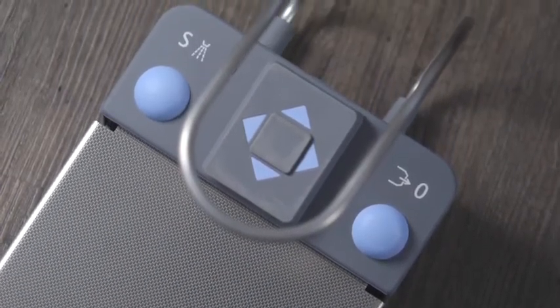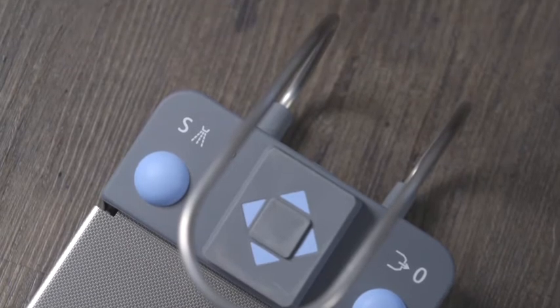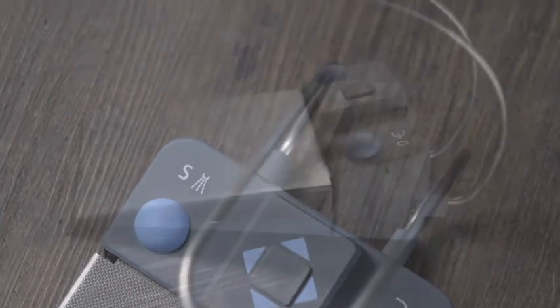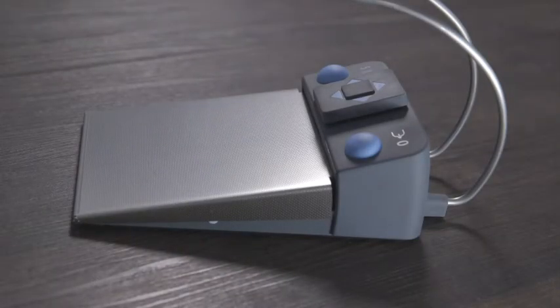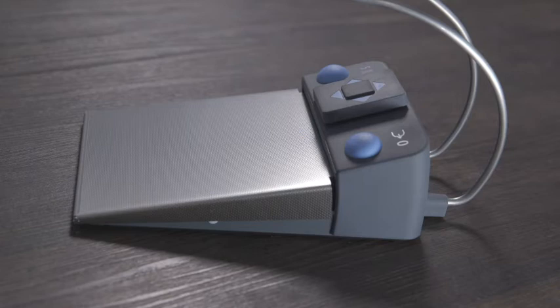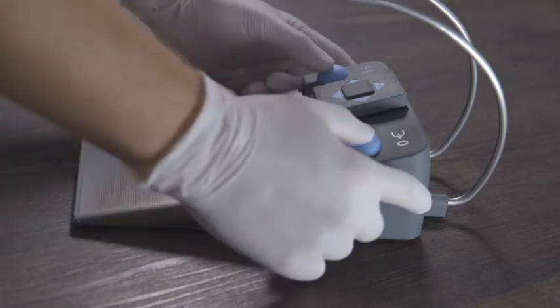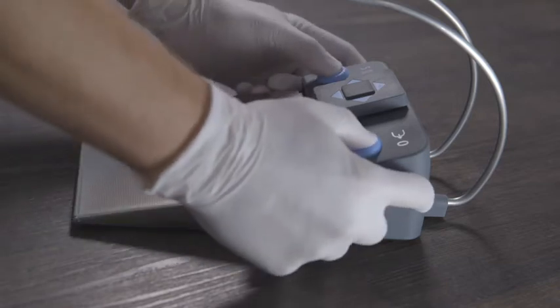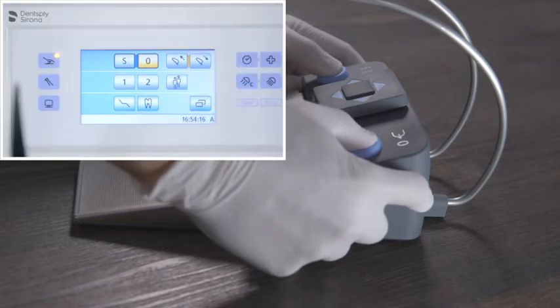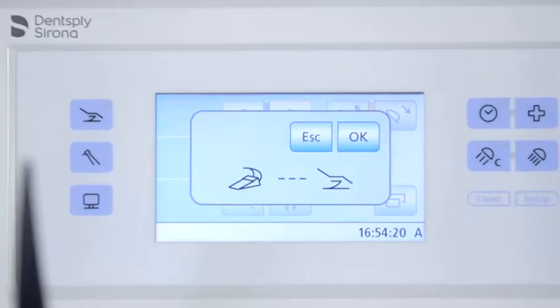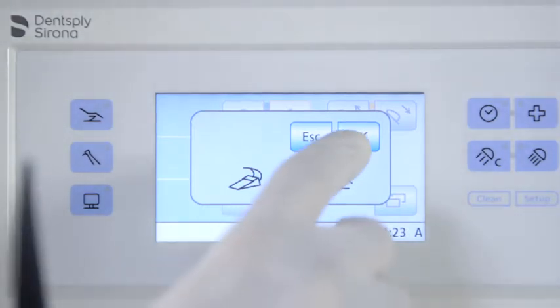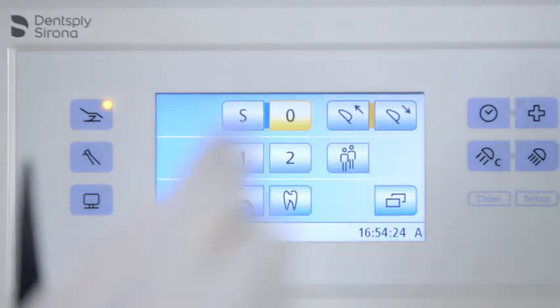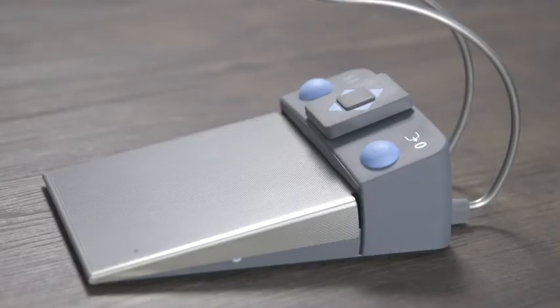When the treatment center and wireless foot control are ready for operation and all instruments are deposited, hold down the left and right button on the foot control simultaneously for longer than two seconds. An acoustic signal sounds and a message appears on the touch panel. Confirm registration with the OK button. The wireless foot control is now assigned to the treatment center.